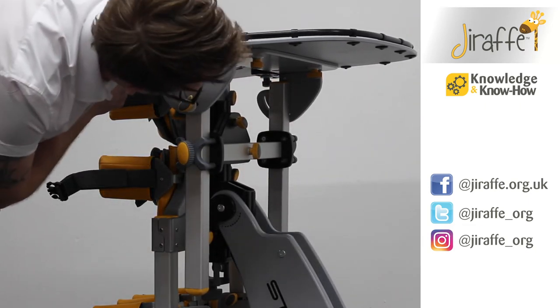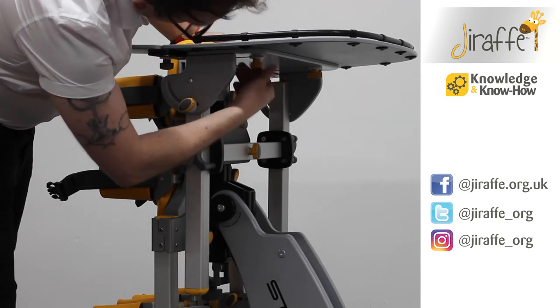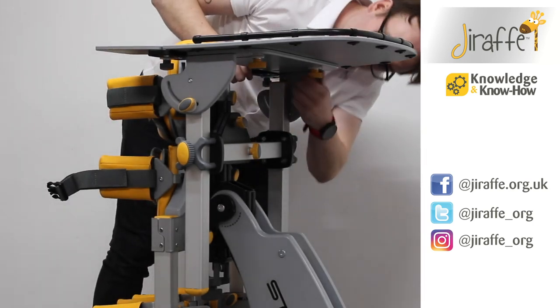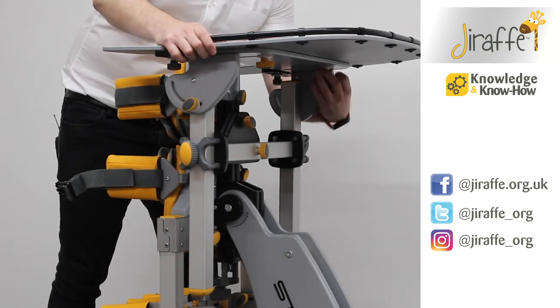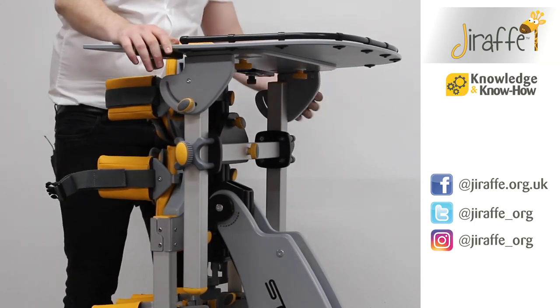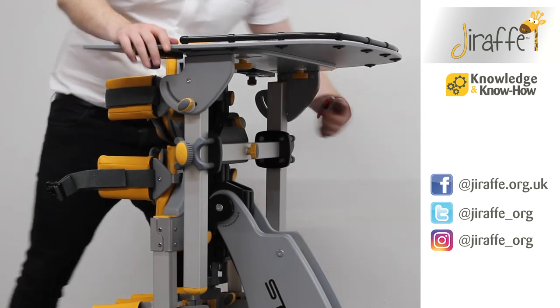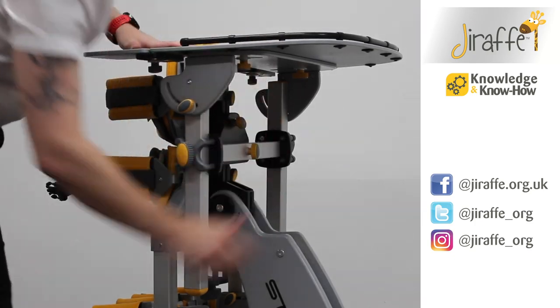If we want to bring the tray closer or further away, there are two more wing knobs underneath the tray. If we loosen both of those off, we're now able to move the tray closer in or further out. Once the tray is in place, tighten the wing knobs and the tray is now secure.